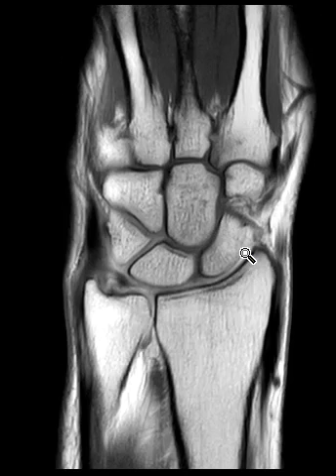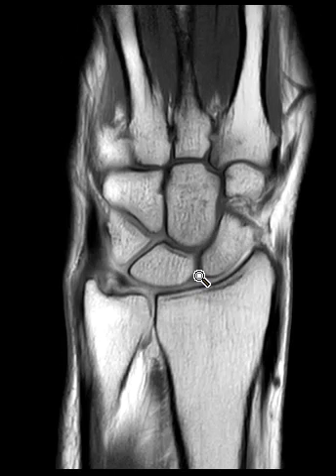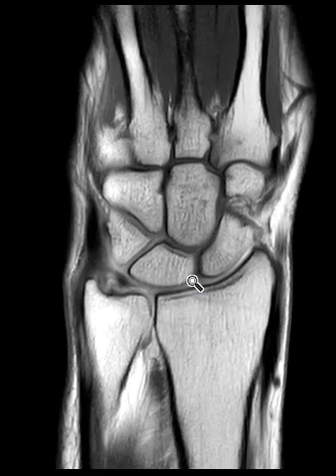That really opens up that dorsal joint, and that seems to work a lot better than when in the olden days I used to go right here, and sometimes it wouldn't work. Never could figure out why, but since I've been going here over the past 10 years or so, I've had really good luck. So this patient has contrast in their proximal carpal row, and we're looking for that triangular fibrocartilage.